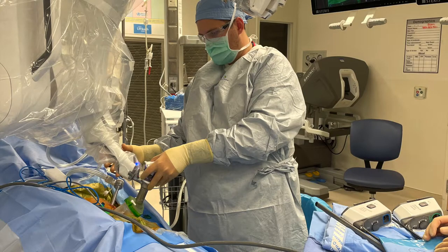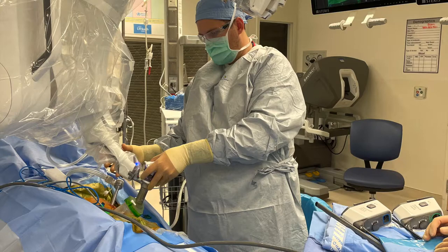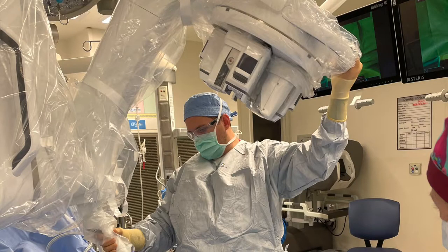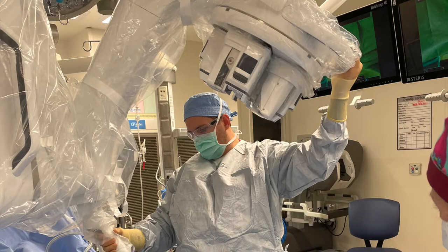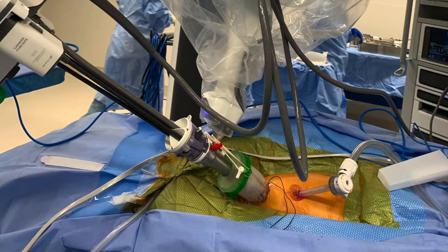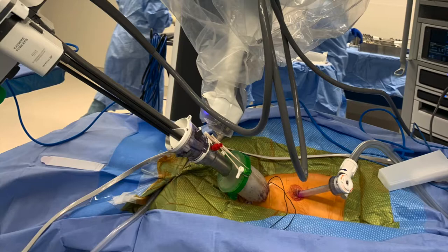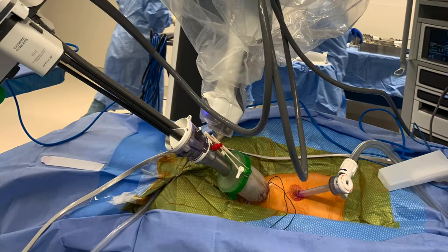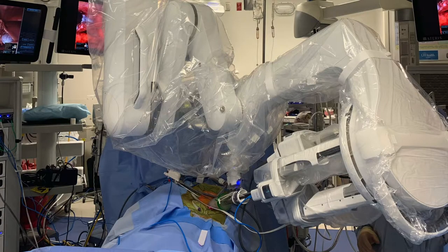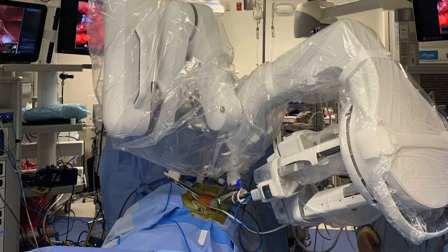This is just an example of my resident bringing the robot in to dock to the trocar. This is adjusting the robotic arm. And finally, this is our setup with the camera and instruments through the cannula — just another shot of the overall setup.